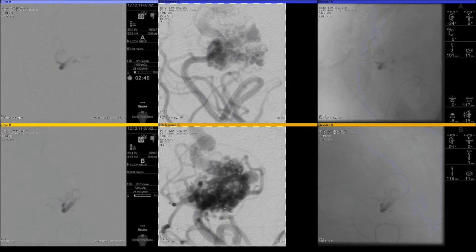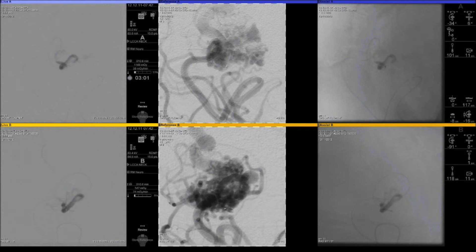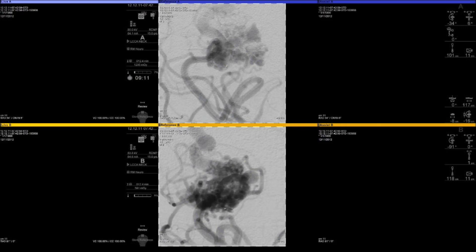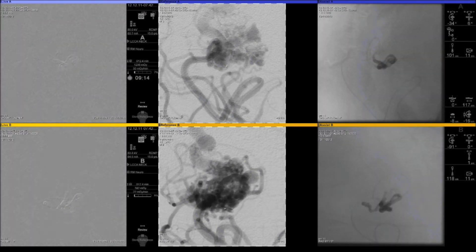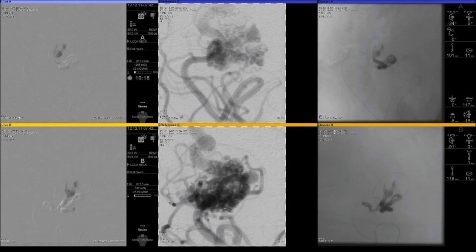I like the navigation of this Marathon microcatheter — it got us into a very good position. I have started using ONX-18 in this AVM. The preference here is because the flow of this AVM is not, in my view, a high-flow AVM. This has also allowed me to build, as you can see here, a very careful initial plug in the proximity of the microcatheter without much reflux at this point.